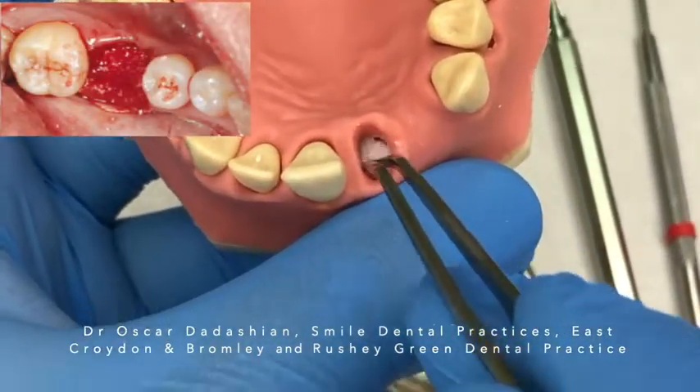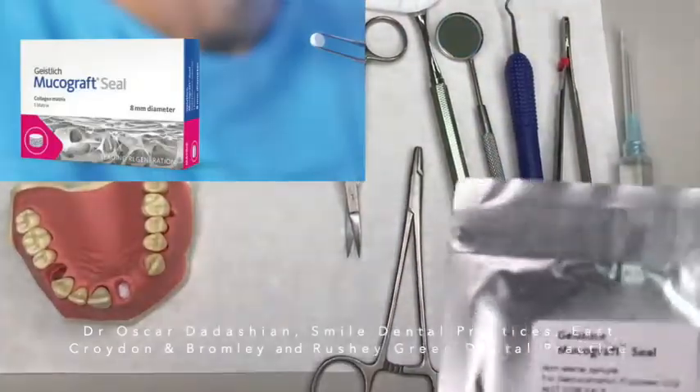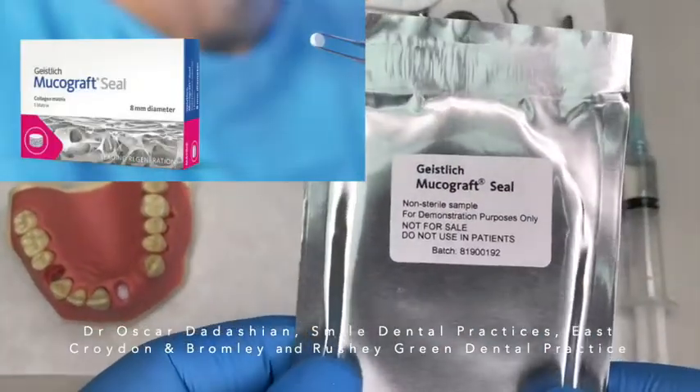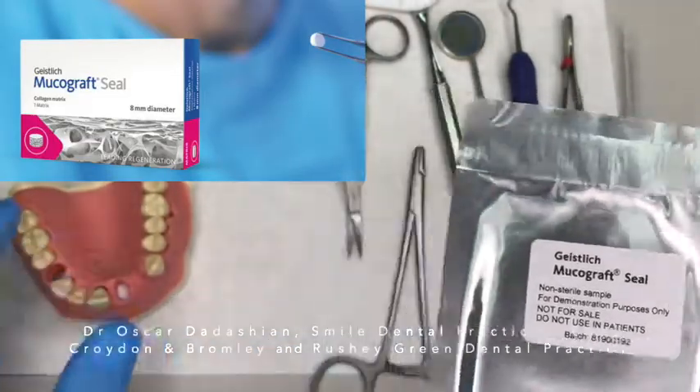If it's not covered, I would encourage bleeding. In this case I'm going to be covering the grafting material with a material called Mucograft Seal. I use this mainly if I want to maintain the soft tissue thickness.